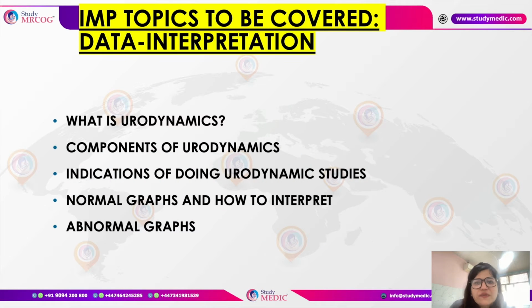So what topics will we be covering in this data interpretation? We'll be learning what urodynamics is, what its components are, what the indications of doing urodynamic studies are, how a normal graph looks, and what the abnormalities are and how you interpret them.